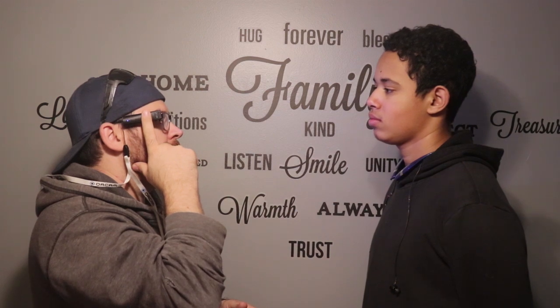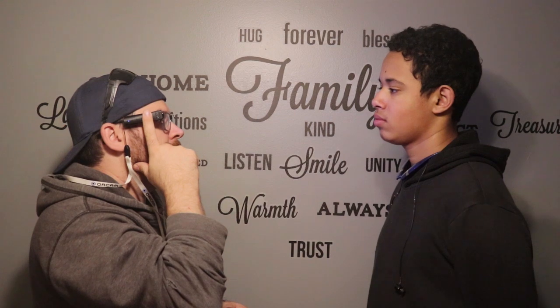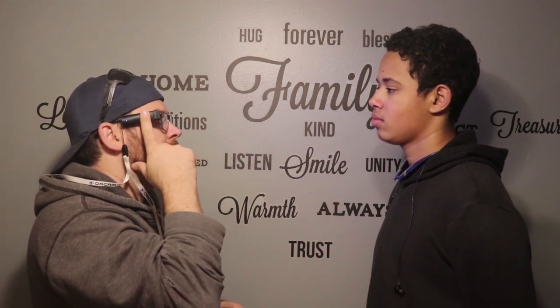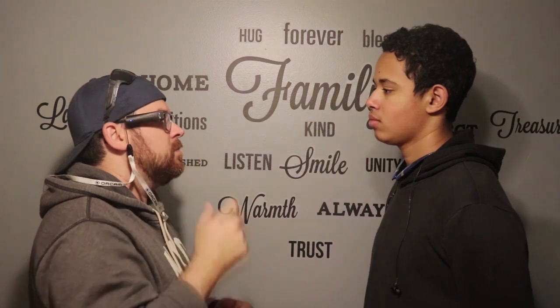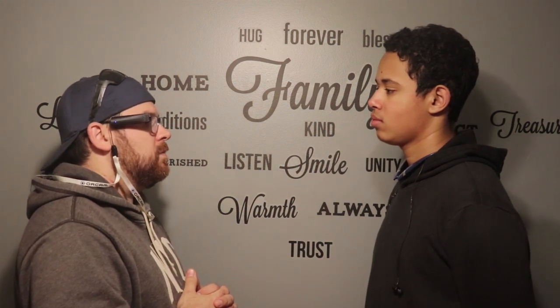Face learning. Please keep holding the bar for up to 30 seconds. Please name the person in front of you after the beep. Nathaniel. Nathaniel. Touch to confirm adding person, swipe to record again, or double tap to abort.